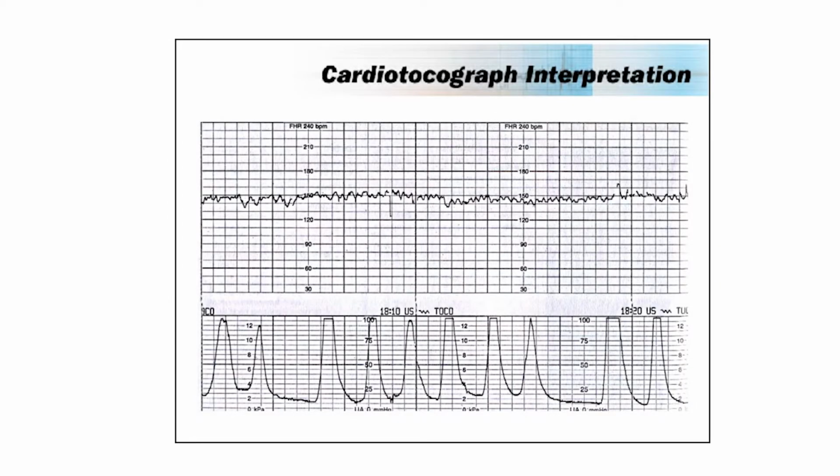We are now at this point here, into 90 minutes of a very similar type of tracing, despite a change of maternal position, strong regular contractions, and 2 vaginal examinations, none of which has provoked any fetal response. No accelerations, no decelerations, nothing. So despite external stimuli, this has remained consistent. Now this to me is much more in line with true sinusoidal patterns.